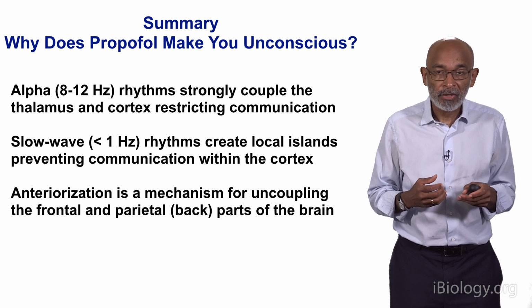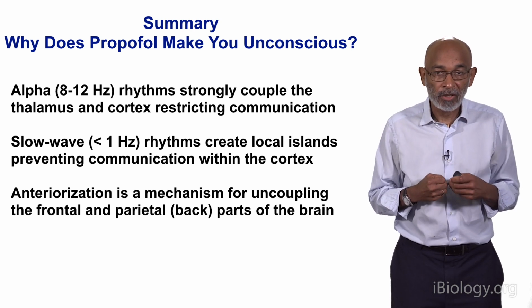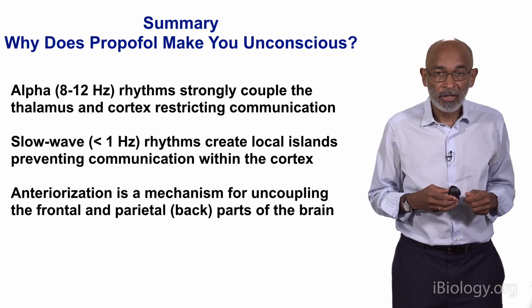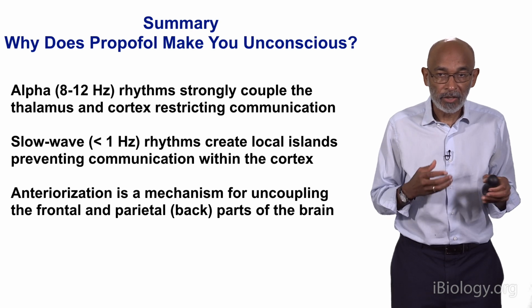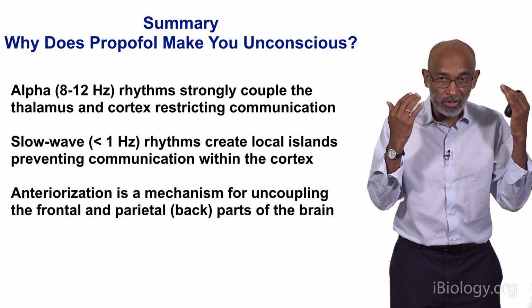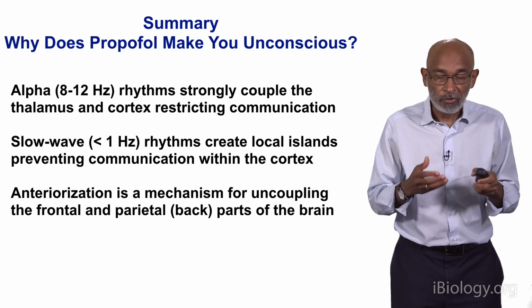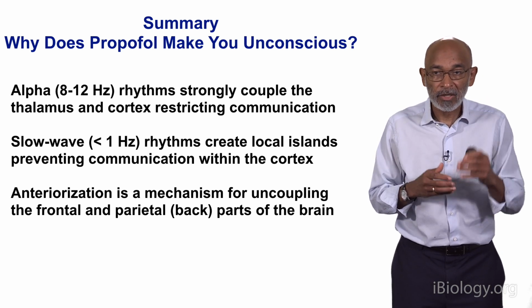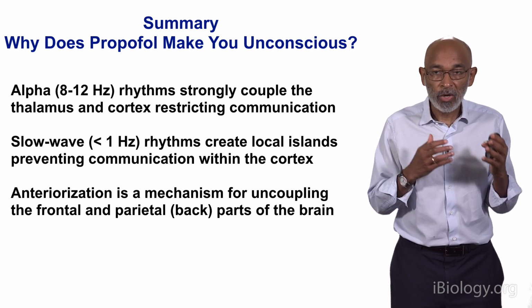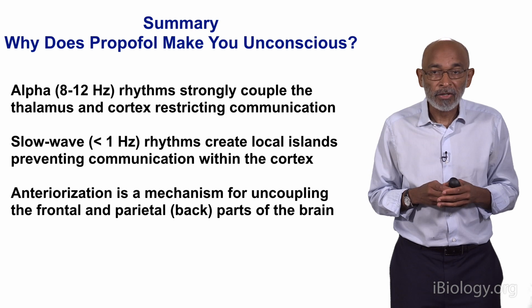anesthesiology is often criticized when we have events of patients being aware under anesthesia and the anesthesiologist didn't know it. So if someone came to me and said, Emery, the last time I had surgery, I had awareness, I was awake and the anesthesiologist didn't know it, I'd say, well, that's not going to happen. So I'd use the EEG. I would administer propofol or one of the other agents until I saw dynamics like the ones I'm showing you here. And if anything I've suggested is even approximately correct, I have a way of knowing when a person is sufficiently unconscious such that he or she wouldn't have awareness.